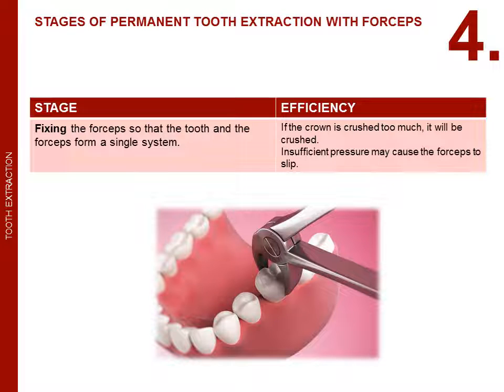Fixing the forceps so that the tooth and the forceps form a single system. If the crown is squeezed too much, it will be crushed. Insufficient pressure may cause the forceps to slip.